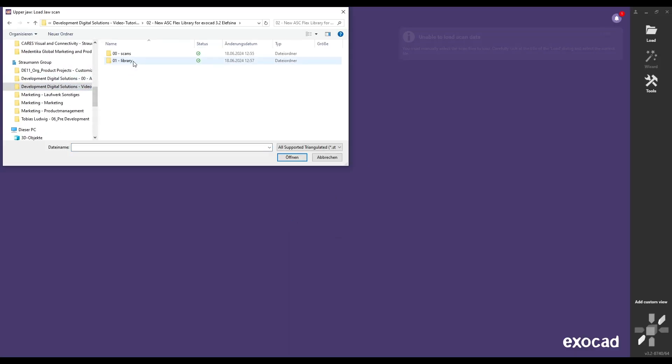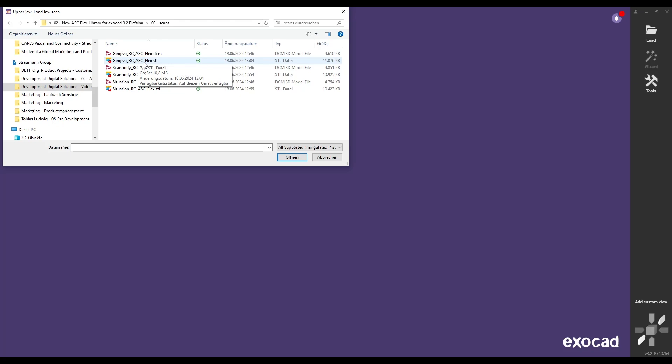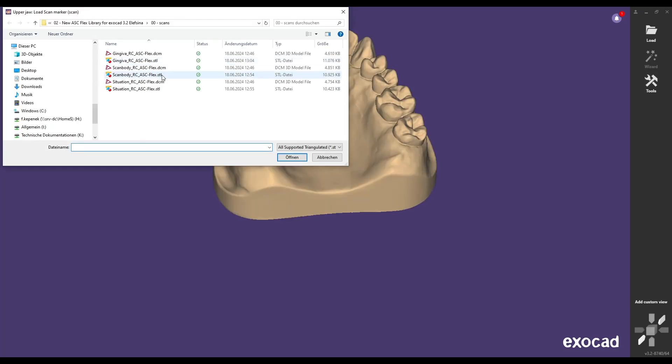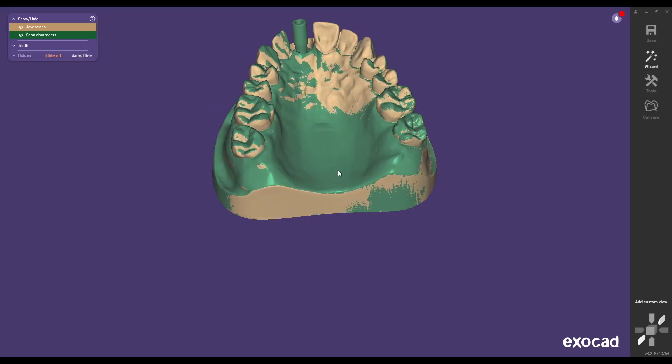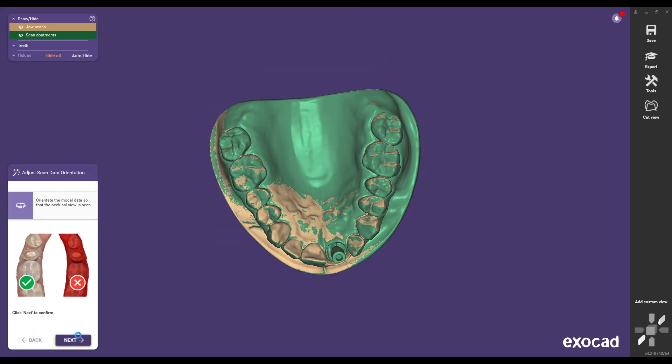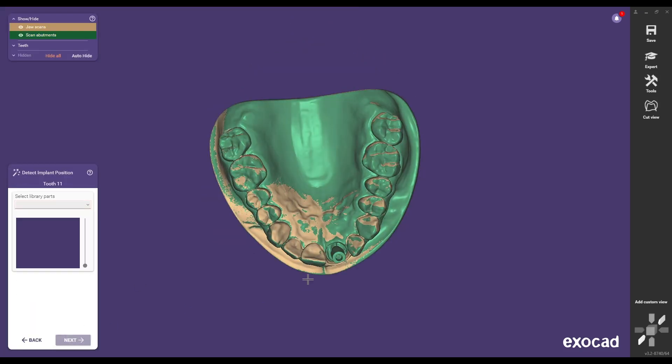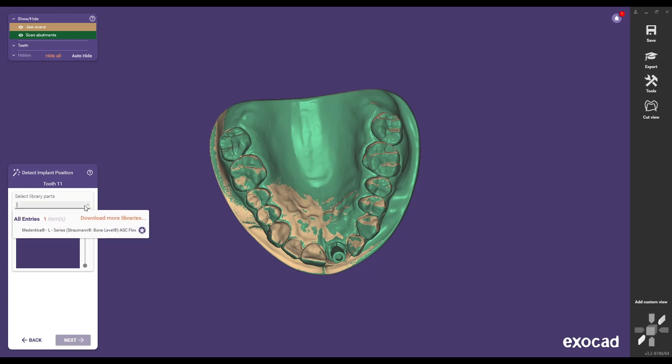Begin by creating your order in ExoCAD Elefcina 3.2 and upload the required scans. Select the CAD library that matches your order. In this example it is the L Series of Medentica compatible with Straumann bone level.